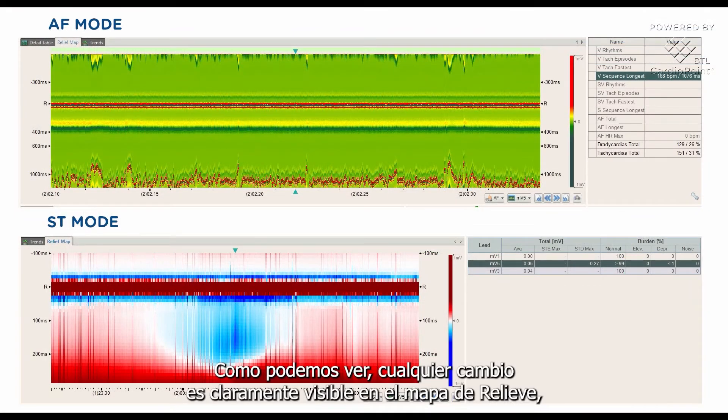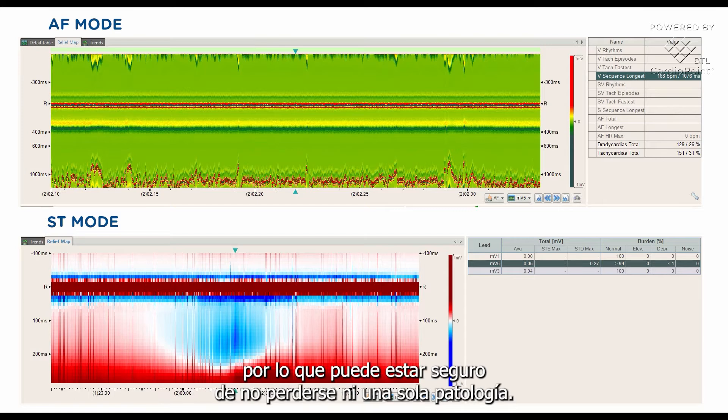As we can see, any changes are clearly visible on the relief map, so you can be sure not to miss a single pathology.